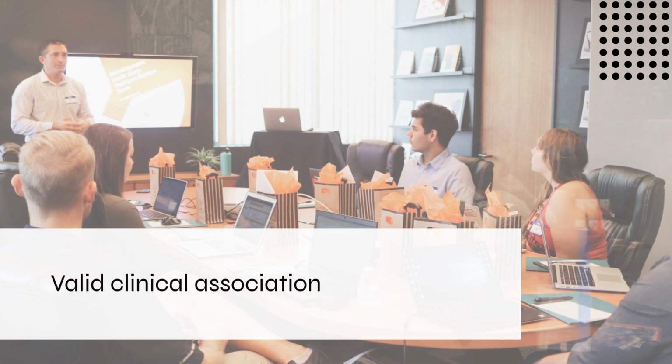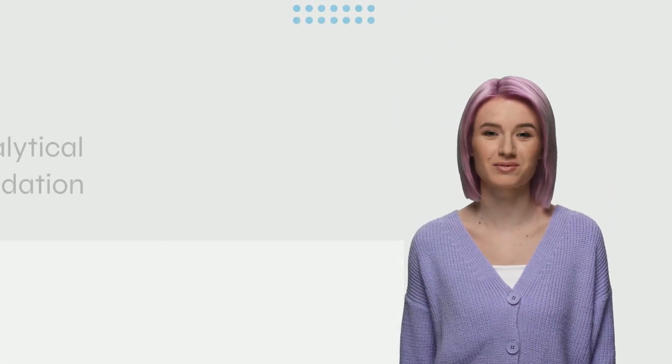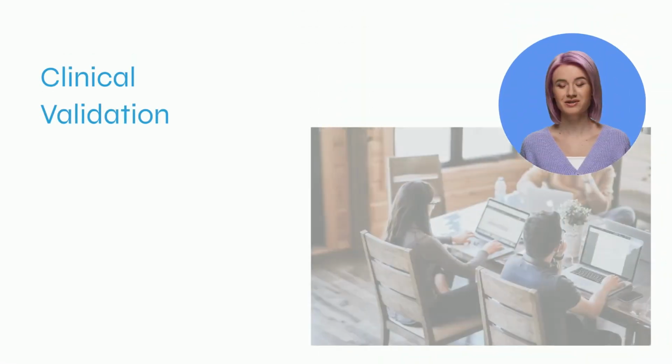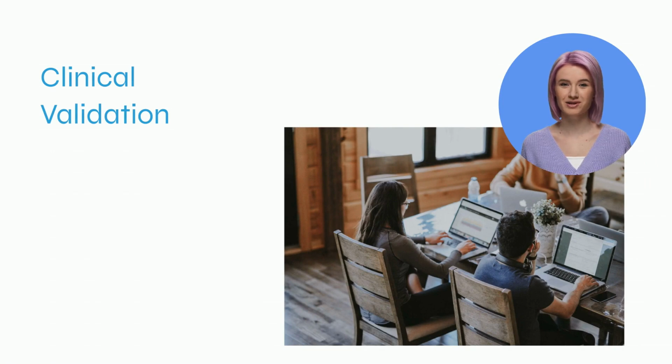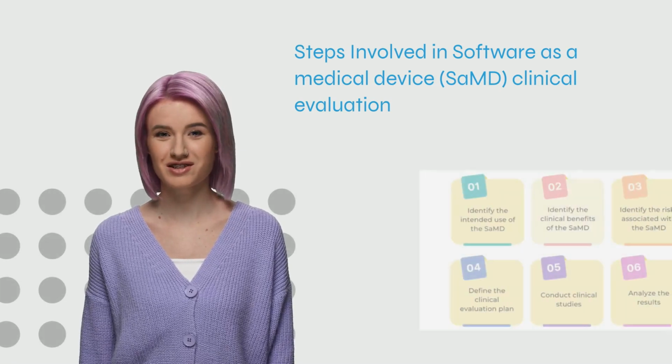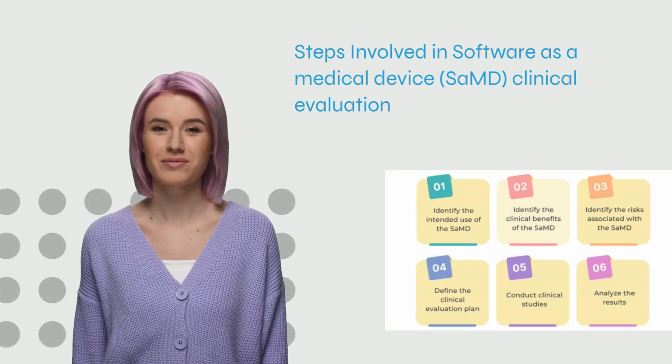They are: does your SaMD output have a valid clinical association with the targeted clinical condition of your SaMD? Can your SaMD process input data accurately, reliably, and precisely to generate output data? Can your intended purpose for the target population in the context of clinical care be achieved through the use of your SaMD's accurate, reliable, and precise output data? Furthermore, there are several steps in SaMD clinical evaluation.